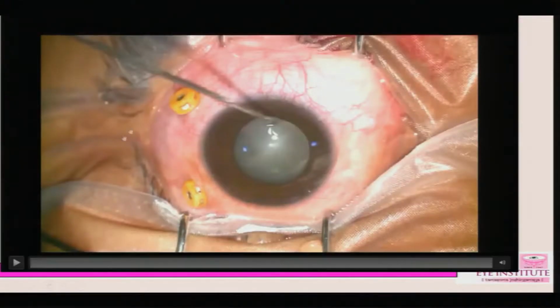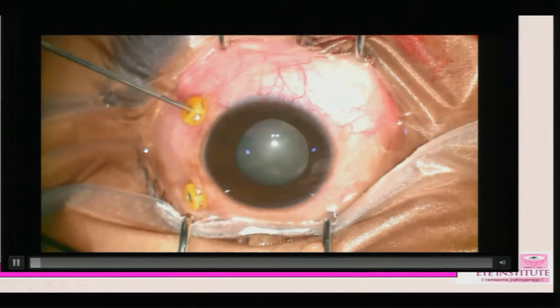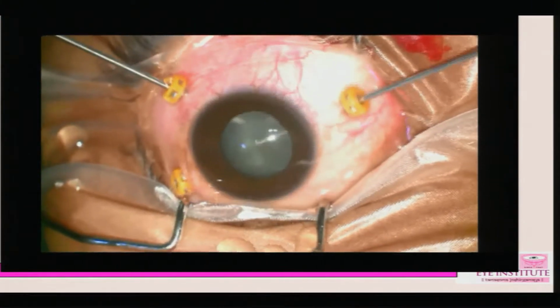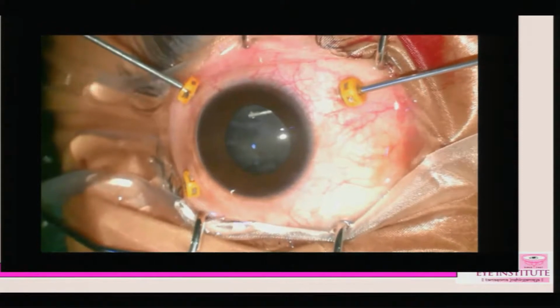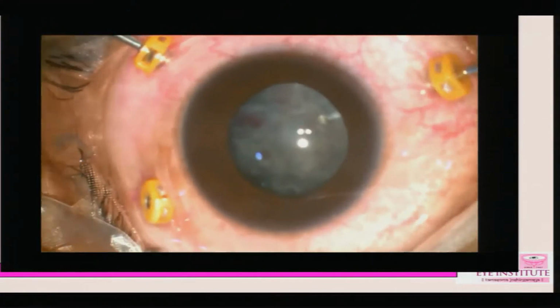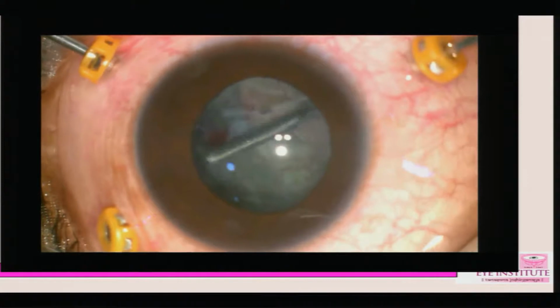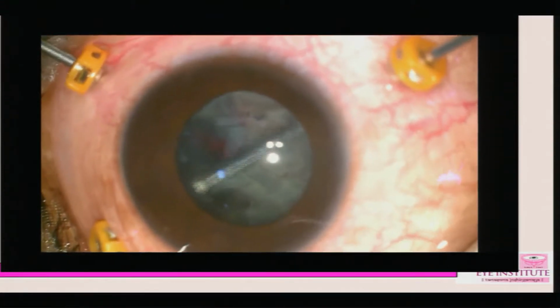And this is another challenging case. Actually, the boy was in a blind school, because he went to many of the surgeons nearby, and they stated it's an inoperable case, and he went to the blind school. So once we confirmed, we were using a long needle because we do not want to go subretinal. And once the anterior membranes were cleared, the lensectomy and the anterior PVR were cleared, and then we passed on the main infusion in this.